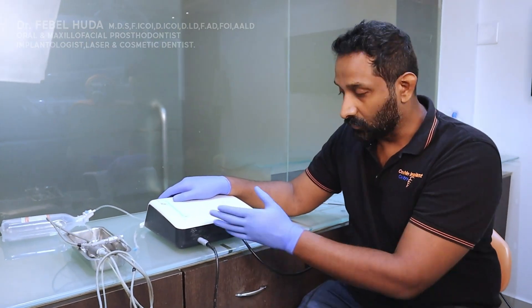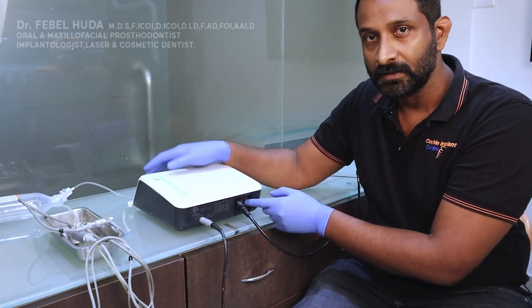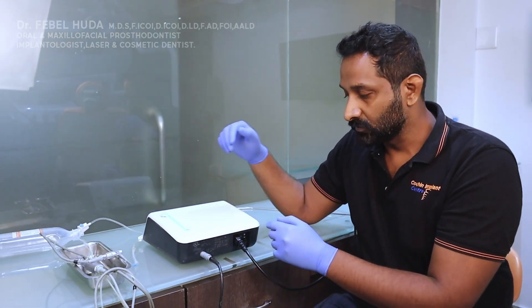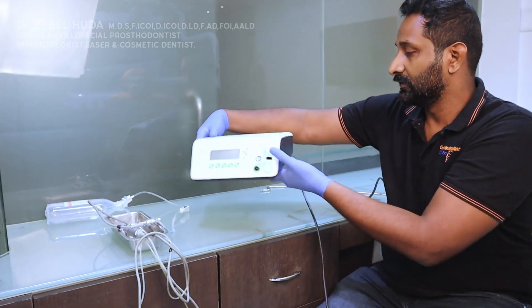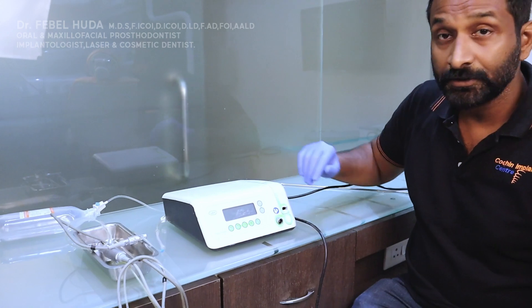That connection is done. You have a switch here to connect your power. Power is now on — I'm just switching it off for the time being and turning the unit over to the other side.